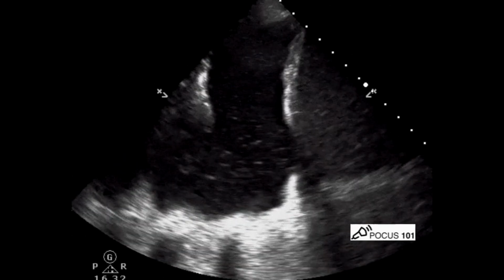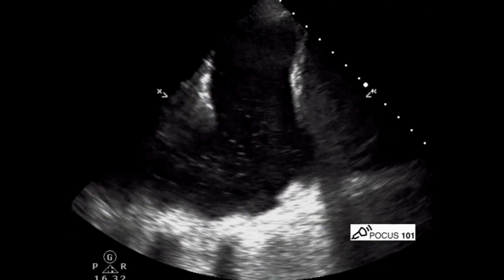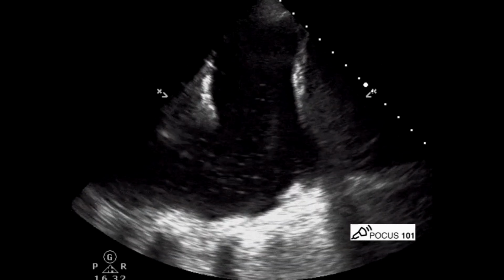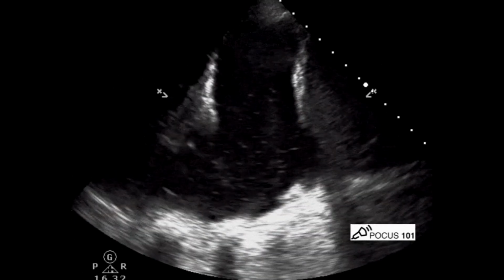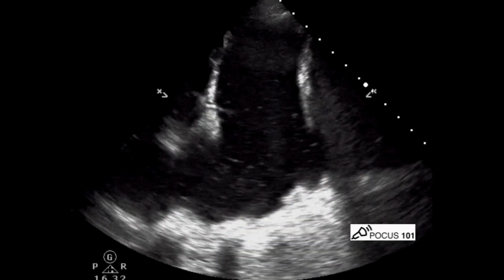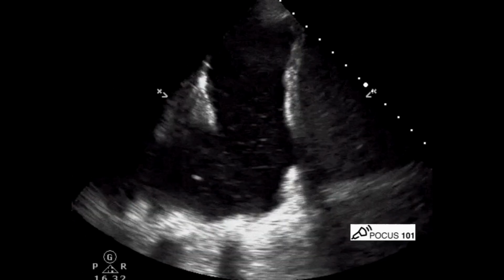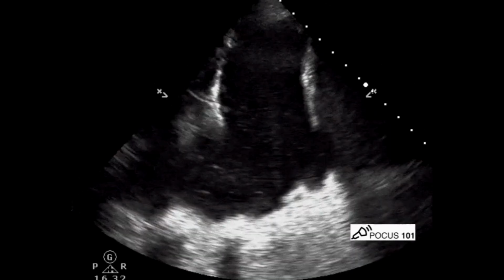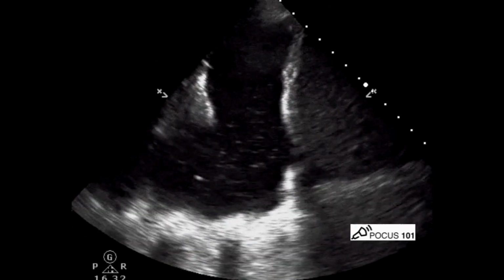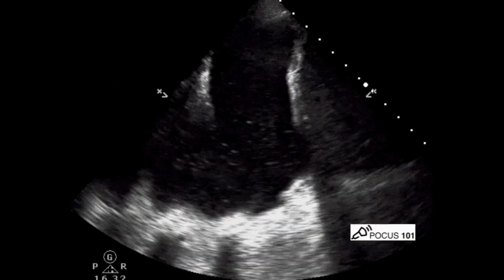So this is pleural fluid, and when you see those things floating around there, it is because of high cellular content. Okay, and it's definitely going to be an exudate. It is sometimes difficult to know whether this is empyema or not, but when you see that it's an exudate, you need to put in a needle anyway. So put in a needle, and it's most likely going to be an empyema.